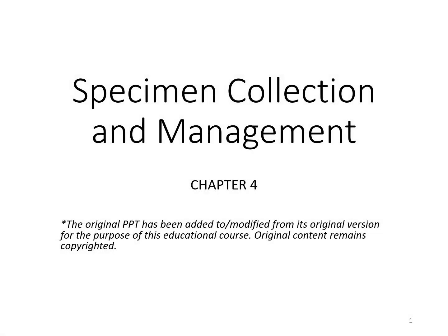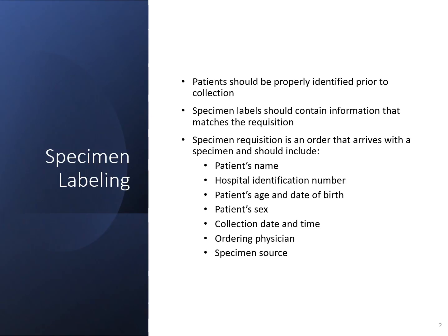In this lecture, we will cover the specimen collection and management of optimal recovery of microbial organisms within clinical microbiology. So for any specimen that is received into the lab, of course, it should be labeled.